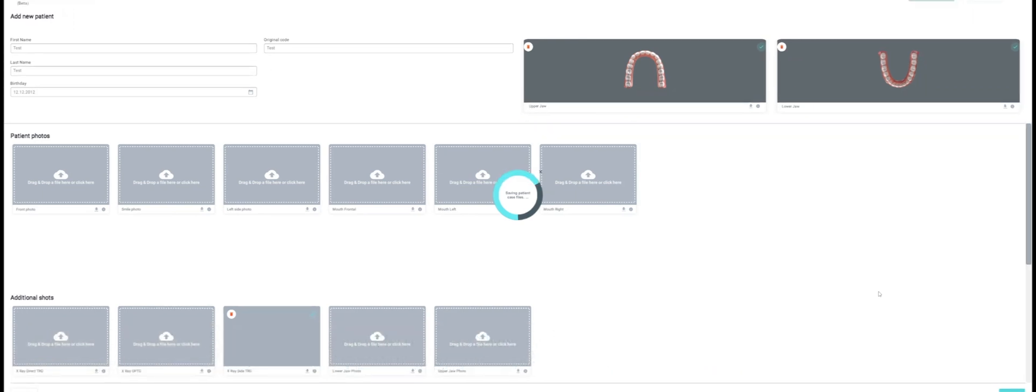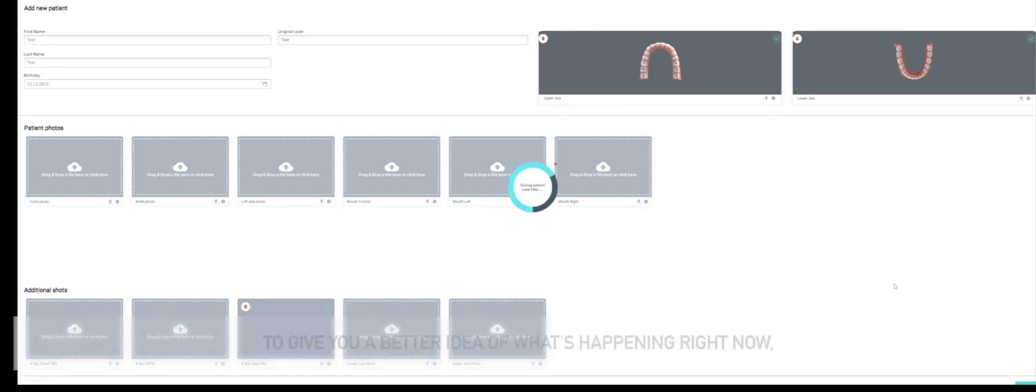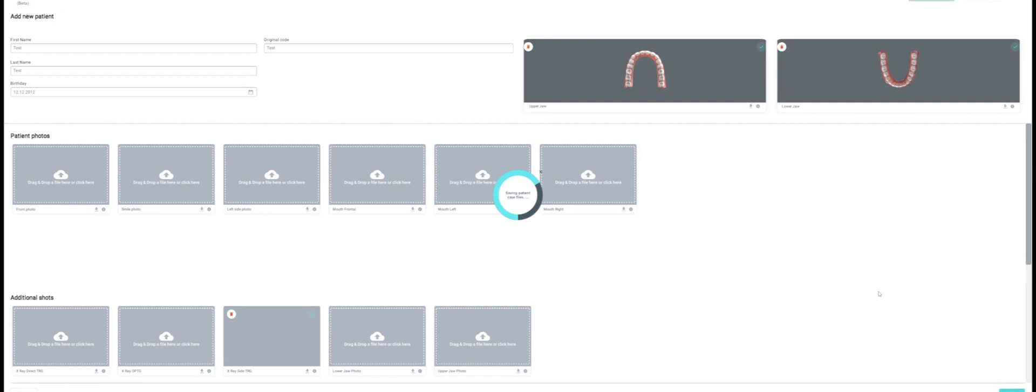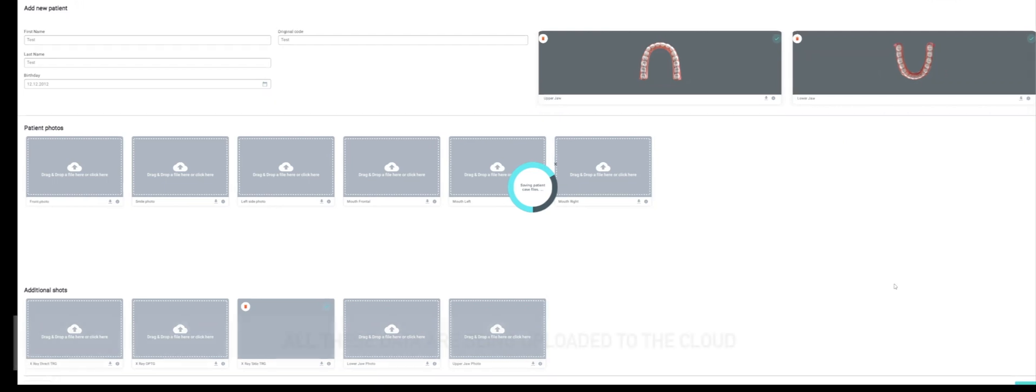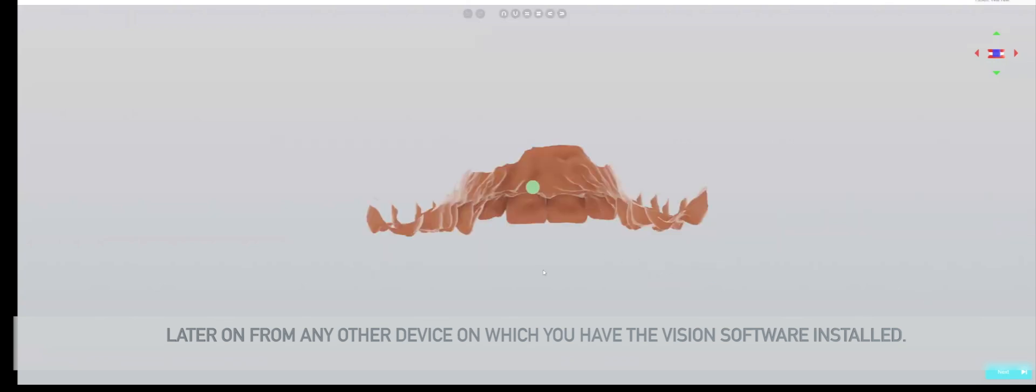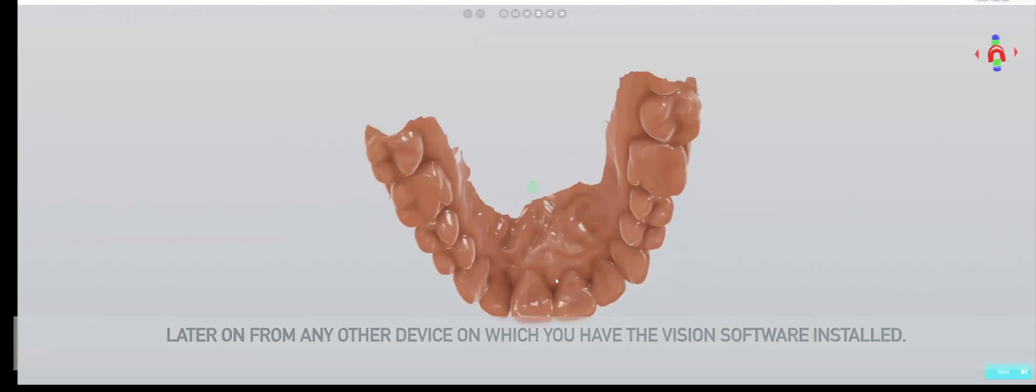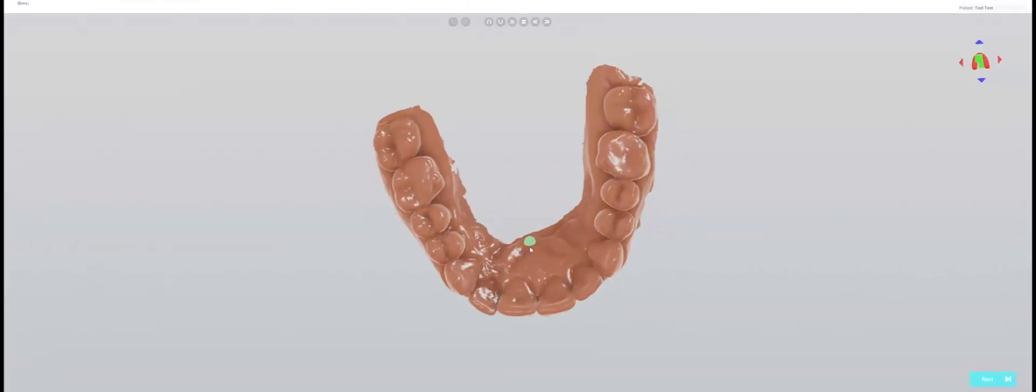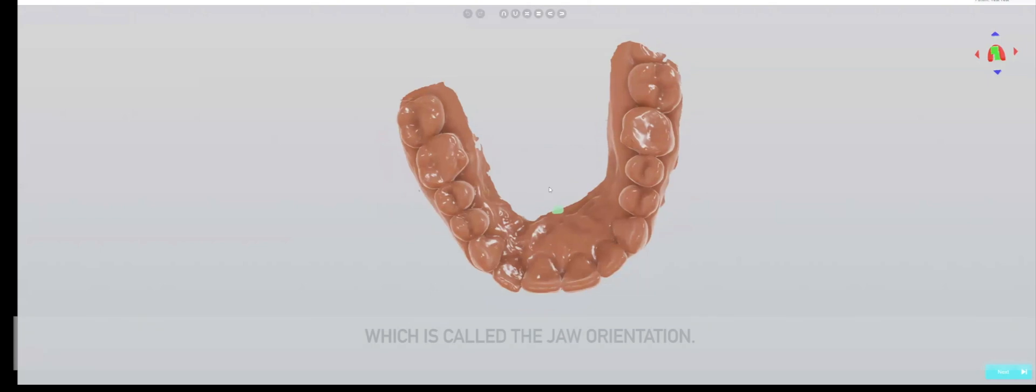Depending on your internet connection, this process will require some uploading and may take a little bit of time. All these data are being uploaded to the cloud so that you are able to use your uploaded data later on from any other device on which you have the Vision software installed.